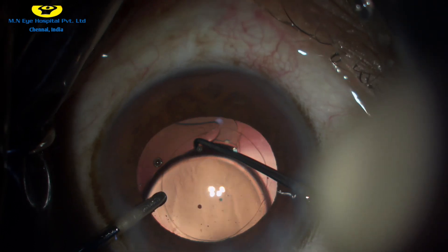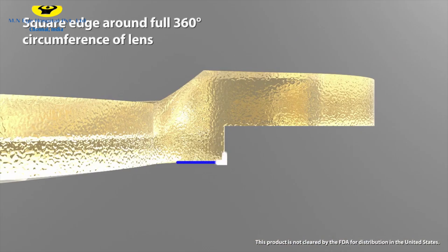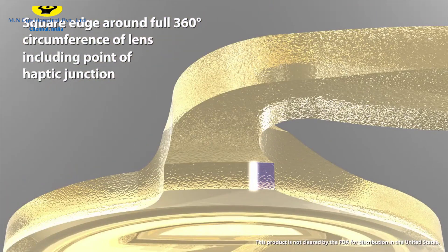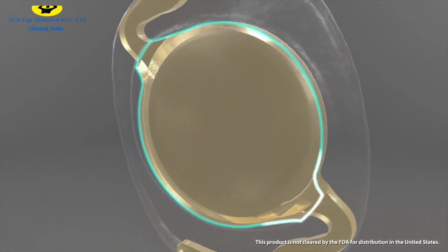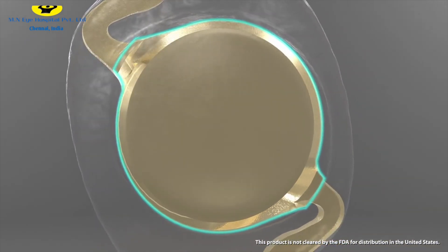The IOL is known for its unique and functional design. It features a square edge around a full 360-degree circumference of the lens, including the point of haptic junction, with only a small gap. This enhances bonding of the IOL surface with the posterior capsule, minimizing the incidence of posterior capsular opacification.